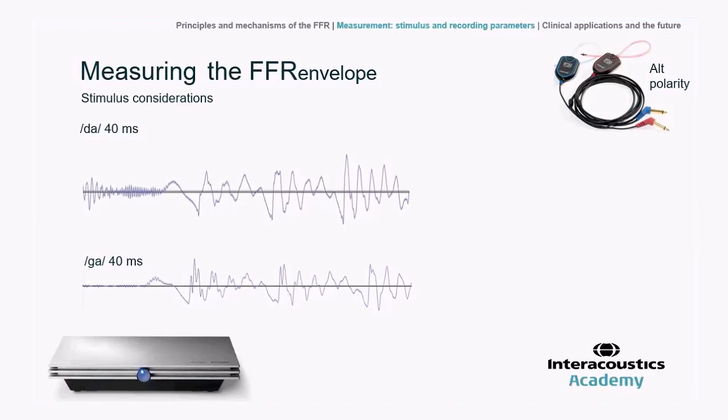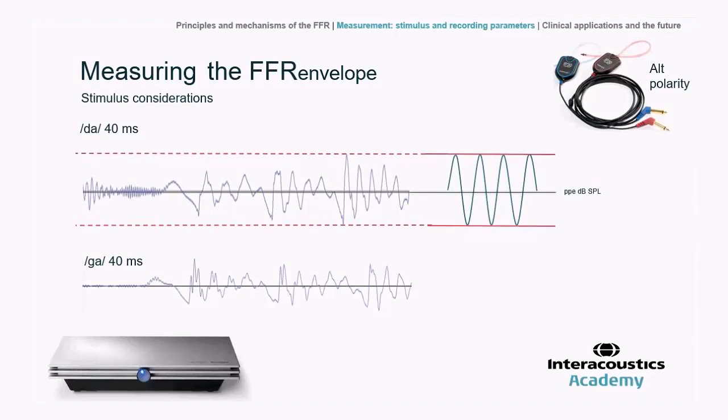Often with the transient ABR, we'd consider intensity levels in dB nHL, for example, clicks, tone bursts, and CE chirps. But the HL scale relies on there being a reference equivalent threshold SPL, something that allows us to relate the SPL value to the average threshold amongst a group of normally hearing individuals for a particular sound and transducer combination. But if these data aren't available, and they're not likely to be for these types of speech signals, as it's not used audiometrically anyway, then that leaves us more in the domain of just SPL. So they're not likely to be displayed in nHL or HL, rather in SPL. And the characteristic way to describe the amplitude or intensity of a stimulus might be the peak-to-peak equivalent method, where the level is related to an easily measurable pure tone, for example.